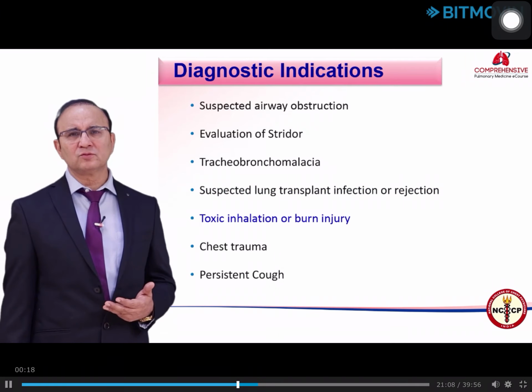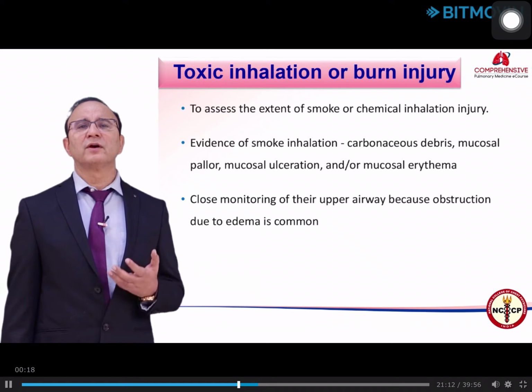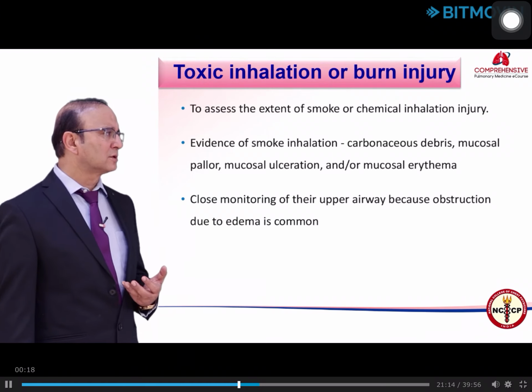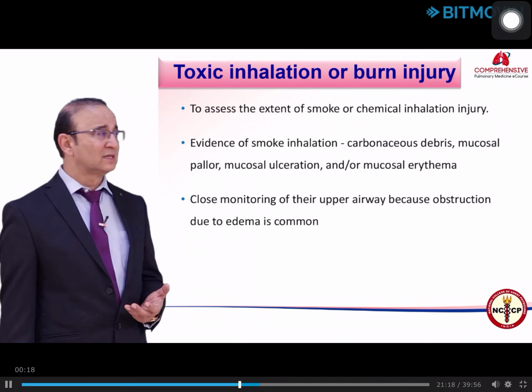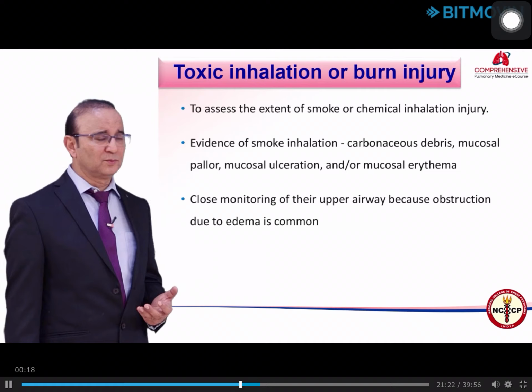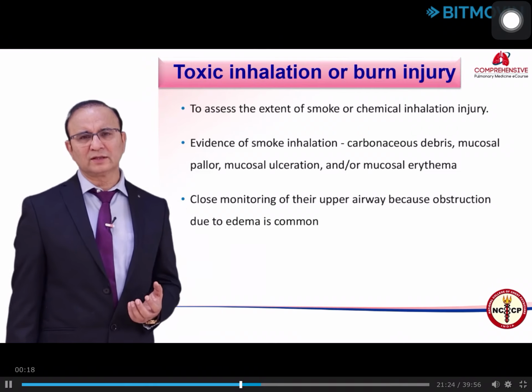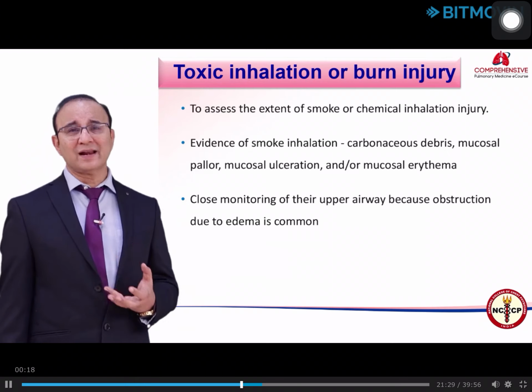Then in a patient who had a toxic inhalation or a burn injury, bronchoscopy is done to evaluate the airways because there could be evidence of smoke inhalation like carbonaceous debris, mucosal pallor, mucosal ulceration or mucosal erythema. And the most important thing in a burn patient is that you evaluate the larynx.